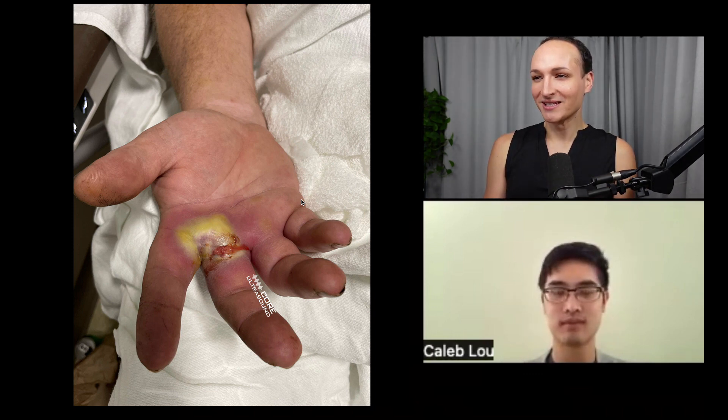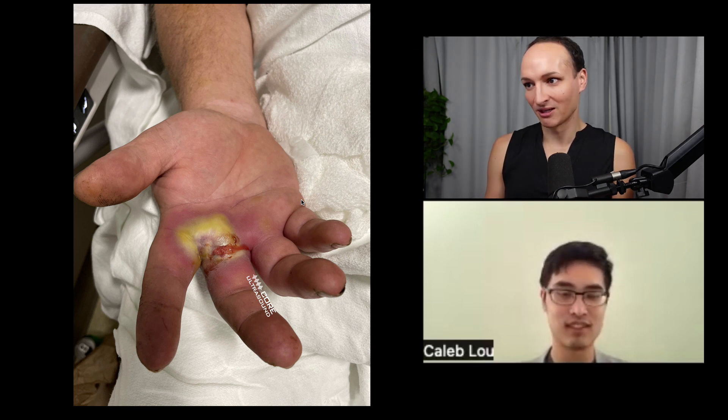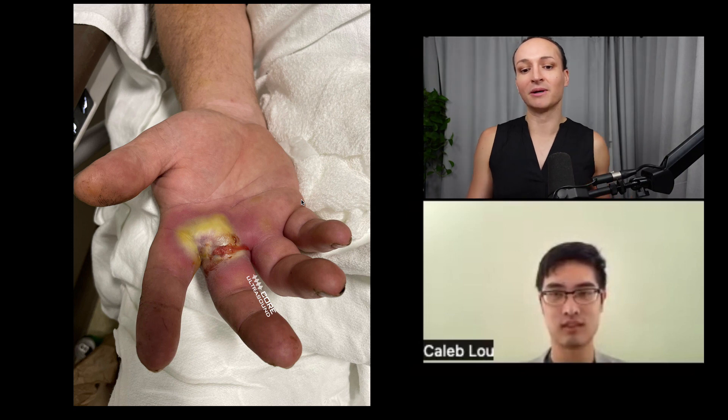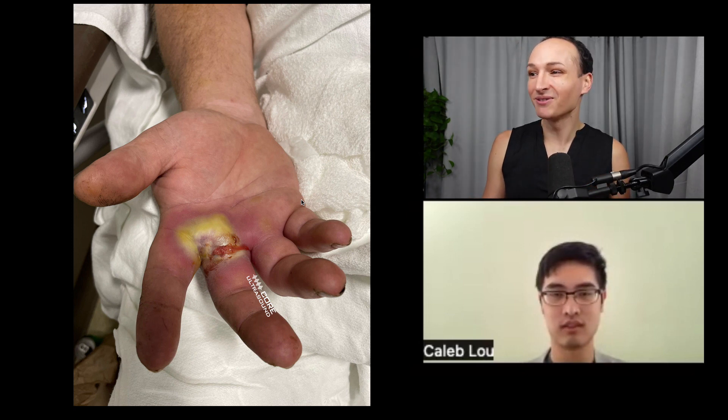Do you think this needs an ultrasound to diagnose as an abscess? No — you can see the pus actually draining. We don't need ultrasound for this. This looks pretty painful though, so in this case I'm going to be using my ultrasound to try and alleviate suffering.